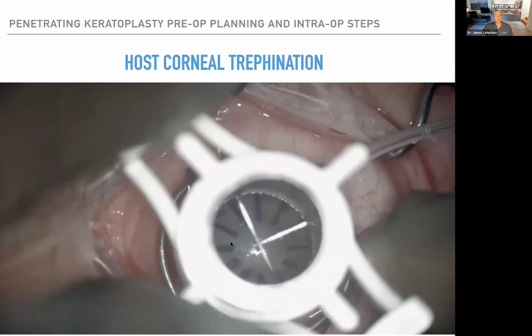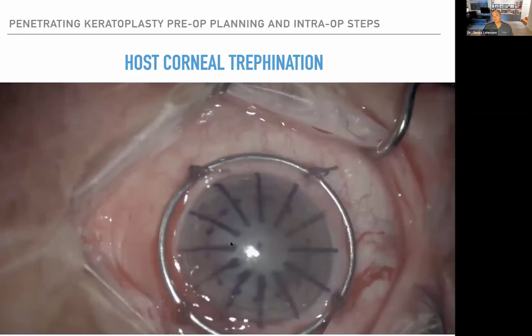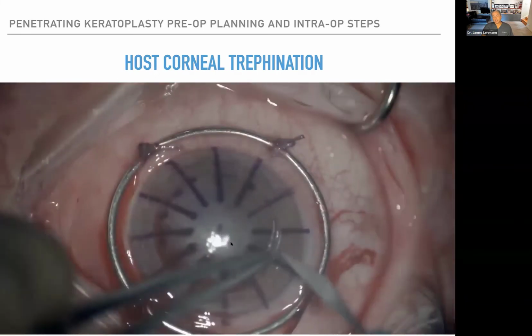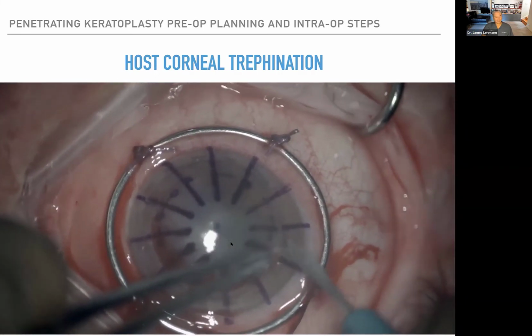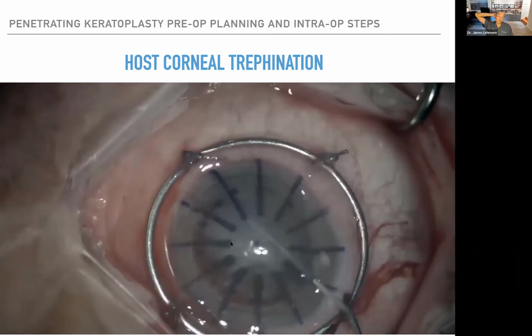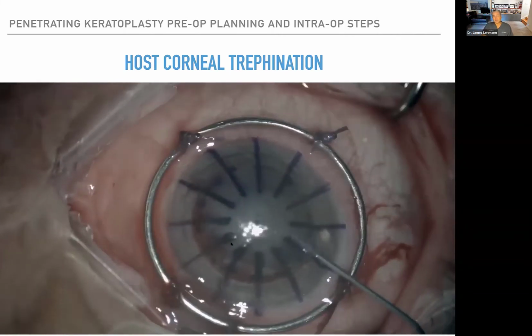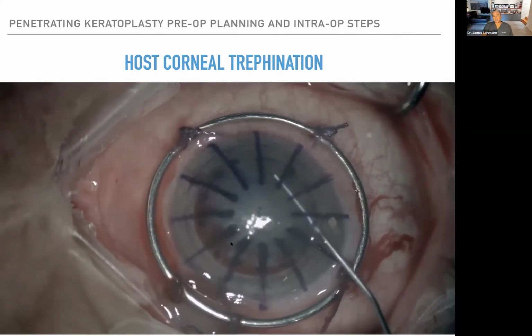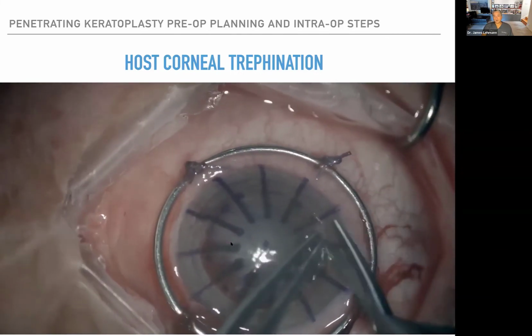I like to go all the way, maybe 400 or 500 microns, because I can enter in the same place every time. So then I lift up and I use a 15-degree blade and make a little slash, and then I fill the anterior chamber with viscoelastic. Generally, we use a cohesive viscoelastic in penetrating keratoplasty because that means we can get it all out at the end of the case. And then you're using these curved corneal scleral scissors in the groove that you had already made.